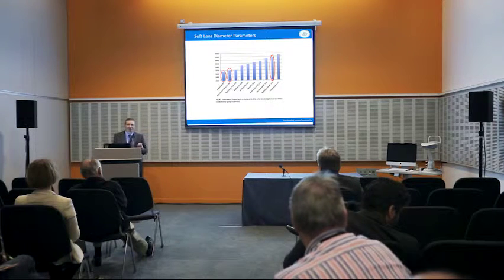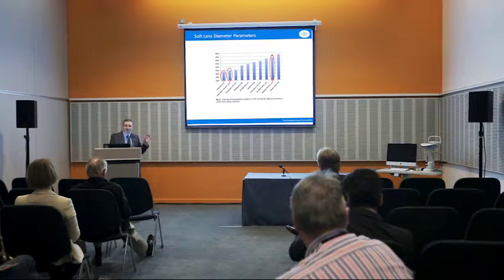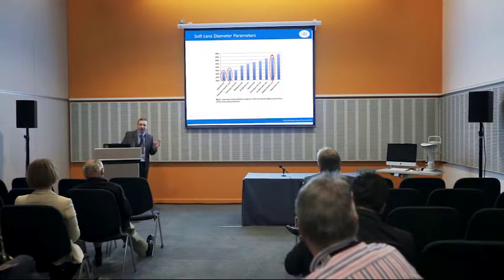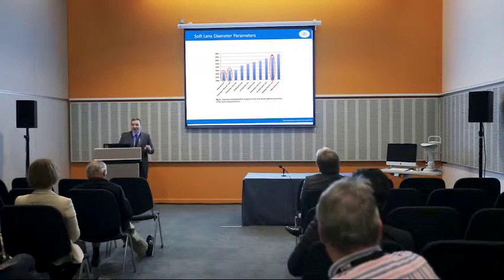Now, many manufacturers are not currently offering that information, but I can tell you, certainly from this study, and actually behind the scenes, there's now a lot of work, certainly Ave, myself, and a few others are looking at trying to measure all of the lenses on the market and be able to provide practitioners with information as to all of the sagittal heights there. So we can start thinking about that sagittal height story and about fitting our patients once we understand that sagittal height data. And I just wanted to show you really the vast differences.